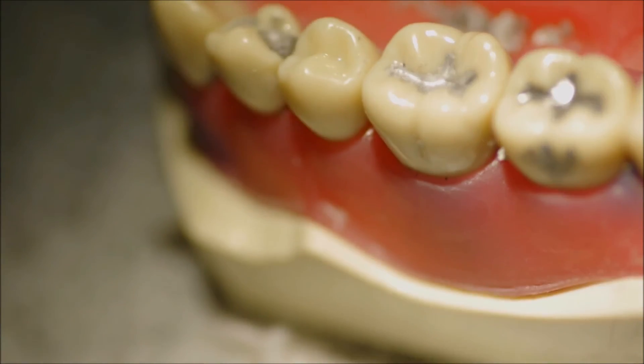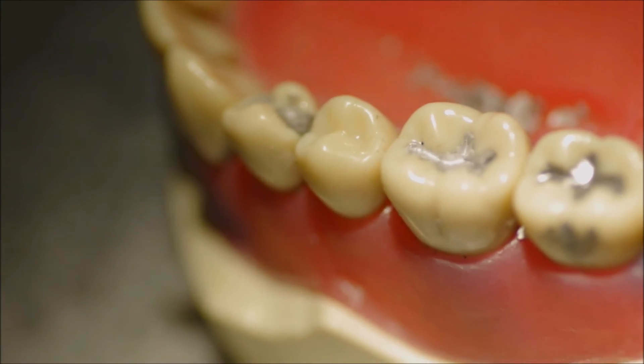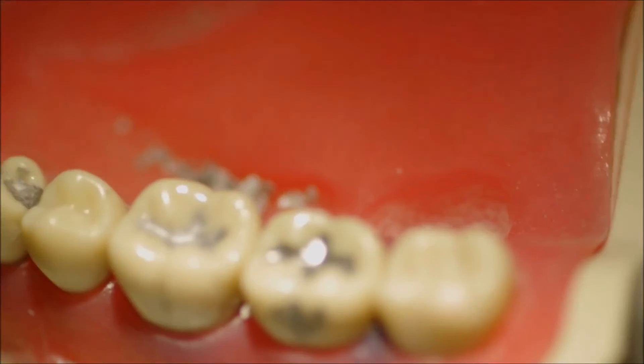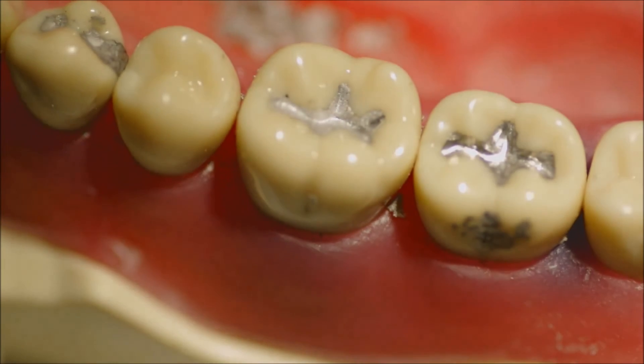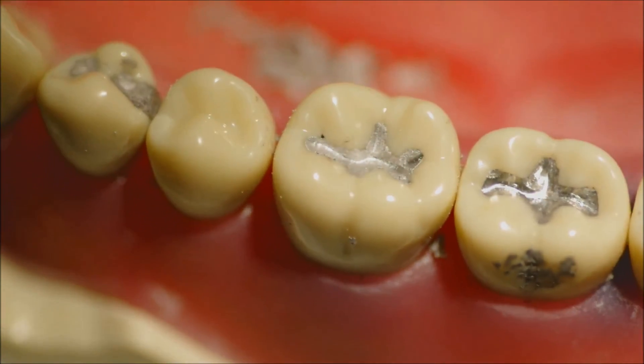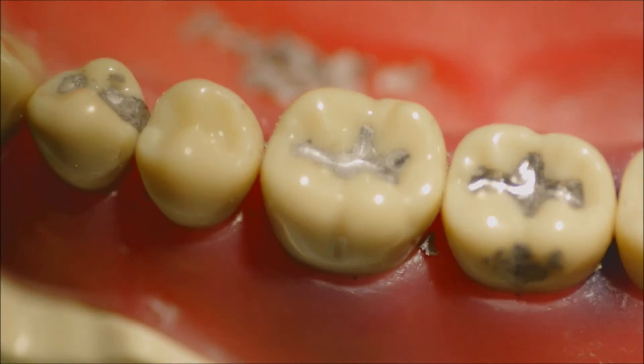A final little bit of cotton to remove any excess flash, and there is a completed restoration. This is not an ideal restoration that would receive five out of five, but it is an acceptable restoration. And you can all do better if it permits. Thank you.